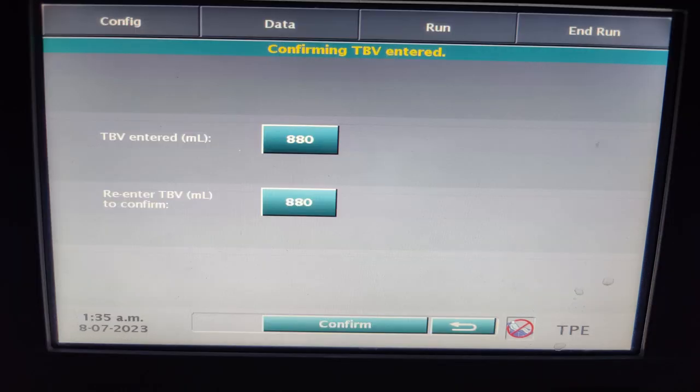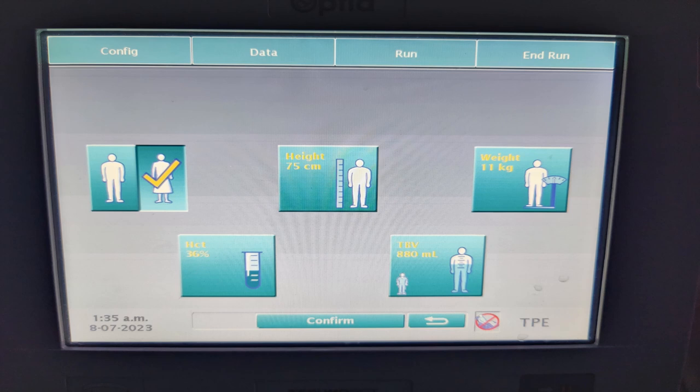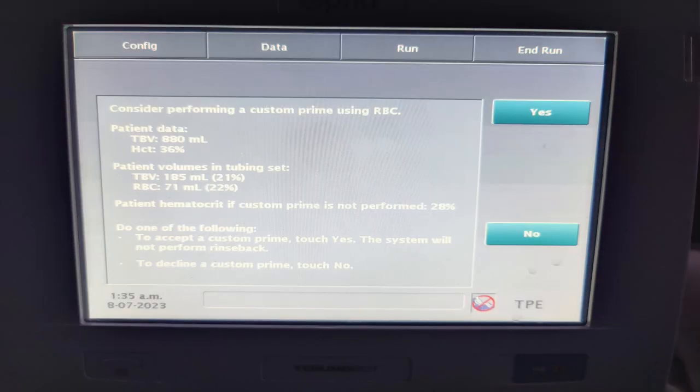Once we enter the TBV, the system will ask us to re-enter it to confirm. Once confirmed, the system will give us the instruction to consider a custom priming, informing us that the total body volume is 880 ml.